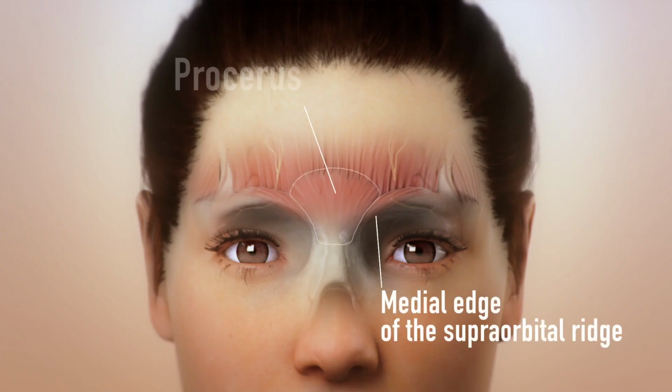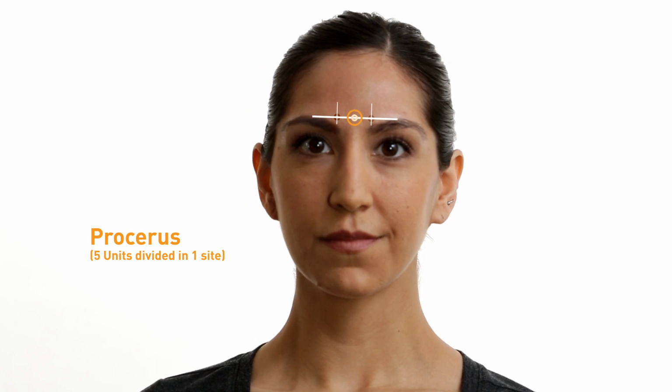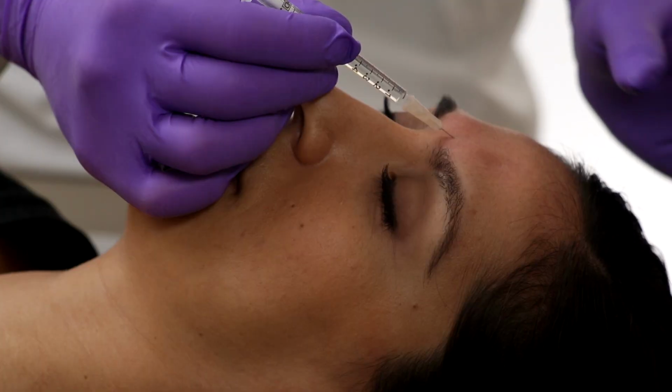The procerus muscle is located midline on the forehead, approximately 1.5 centimeters superior to the supraorbital ridge between the eyes. The injection site for the procerus should be approximately midway between the two corrugator injections. It may be helpful to visualize a single straight horizontal line connecting all 3 of these injections.